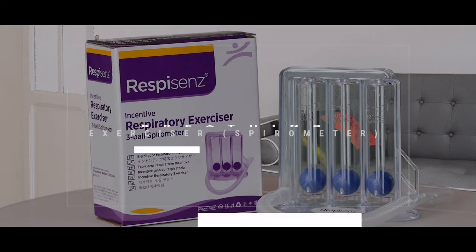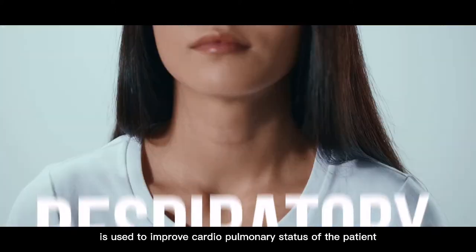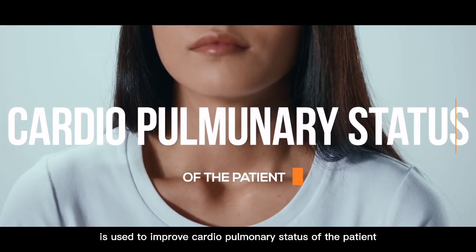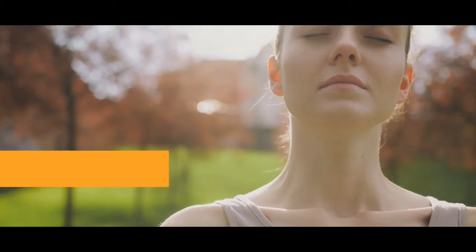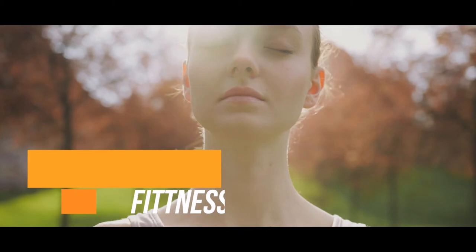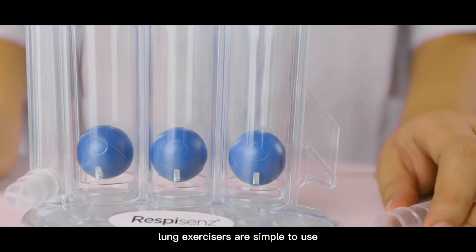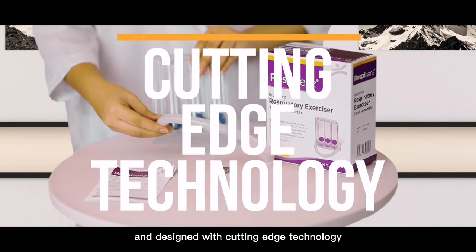Breathing Exerciser. The Respiratory Lung Exerciser is used to improve the cardiopulmonary status of the patient, enhancing the overall fitness and well-being. Lung Exercisers are simple to use and designed with cutting-edge technology.